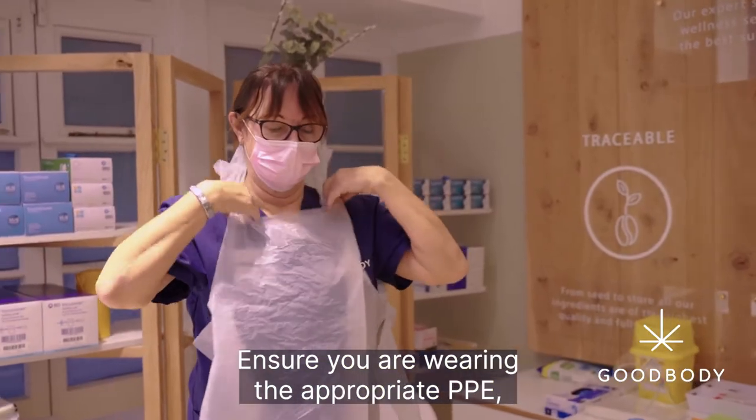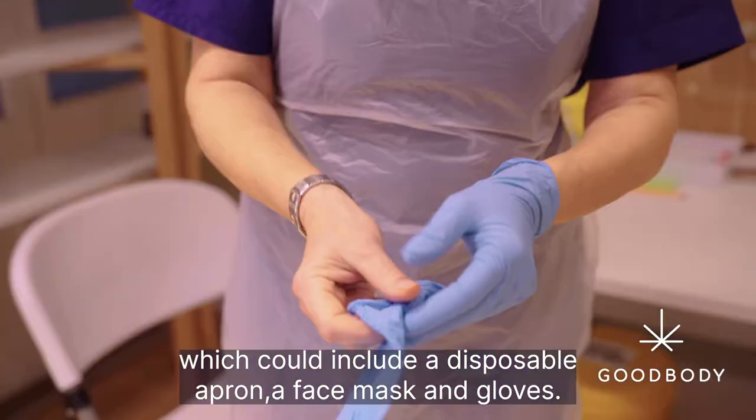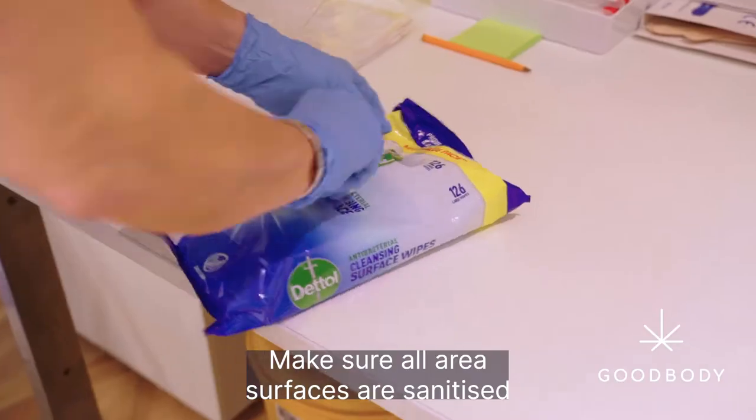Ensure you are wearing the appropriate PPE, which could include a disposable apron, a face mask and gloves. Make sure all area surfaces are sanitised prior to the customer appointment.